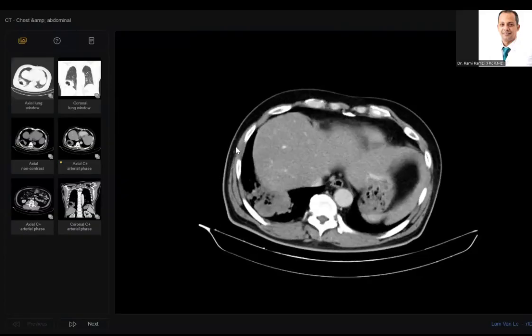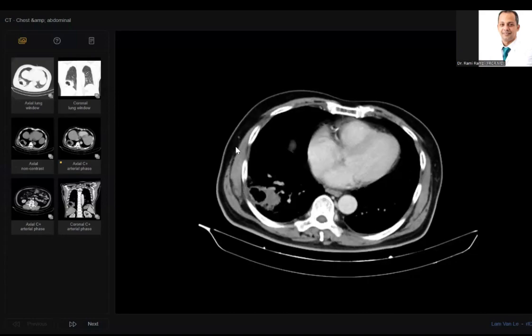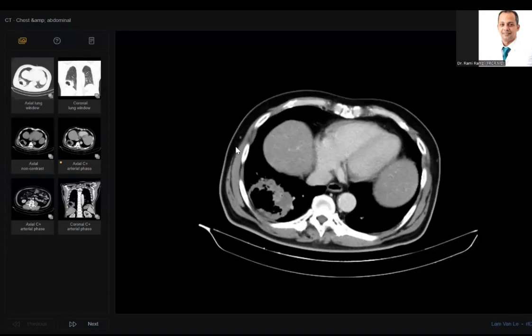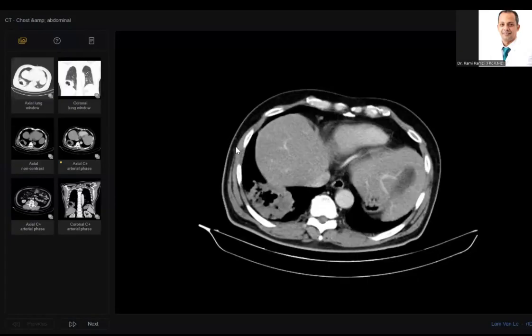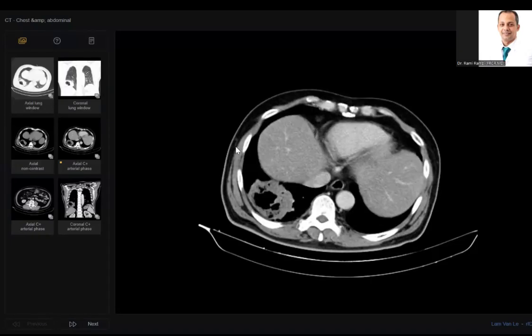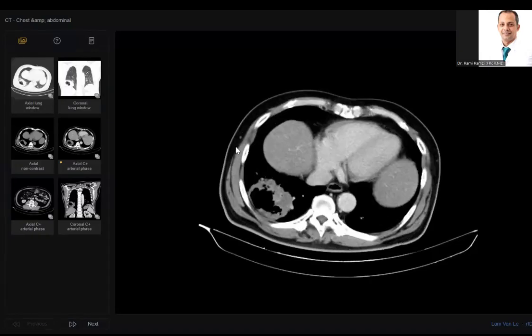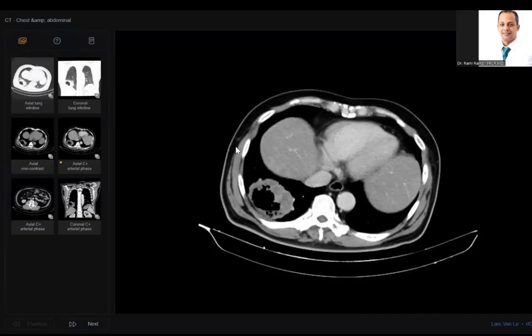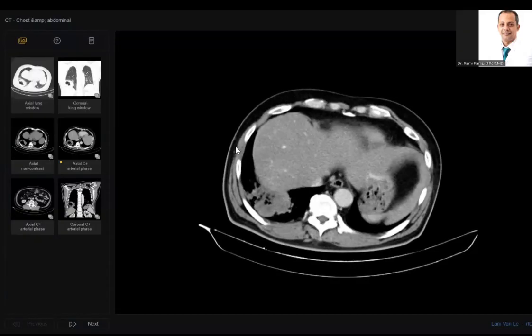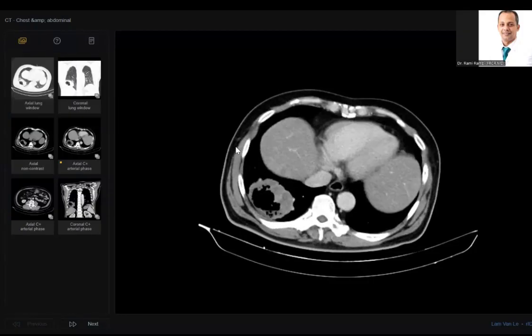I will change the slides and you tell me what is the best pathway to take your biopsy. Stop me whenever you see it is better. Yes, sir, posteriorly we can approach, because at the point where was the best slice having the large amount of soft tissue, because we have to avoid the necrotic central component. I will give you choices.